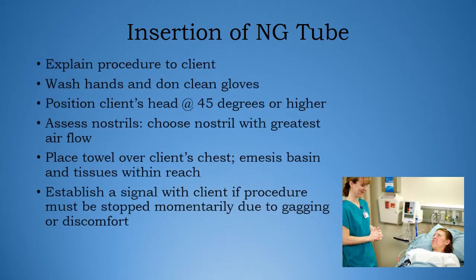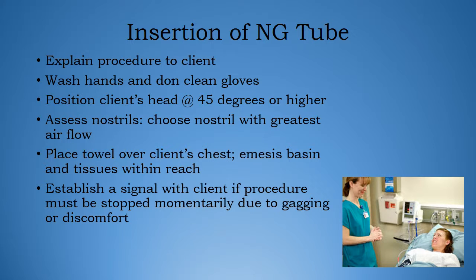Insertion of the nasogastric tube. Explain procedure to client. Perform hand hygiene and don clean gloves. Position client's head at 45-degree angle or higher.